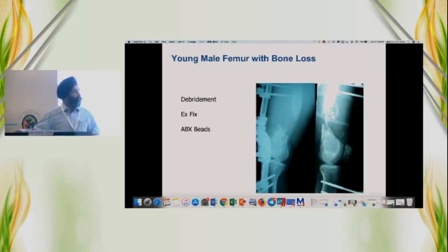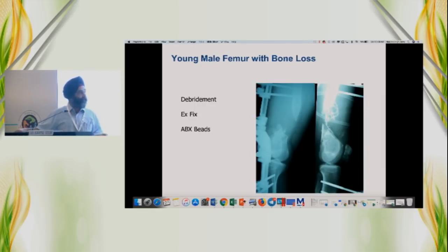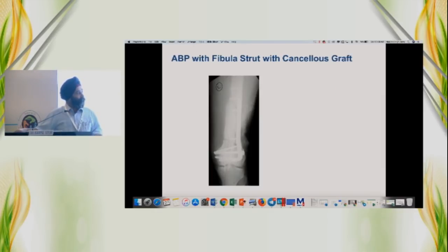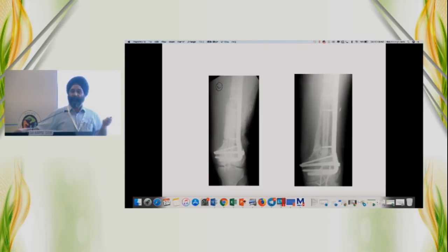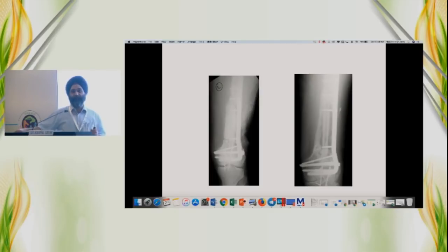Another young male with bone loss — debridement, spanning external fixator, antibiotic beads. Then a fibula was added along with cancellous bone graft. A few months down the line you can see consolidation of the medial cortex; the fibula is still standing proud. These are patients who will need protection for a very long time because fracture of the fibula and fracture of the graft is known. So don't be in a hurry to proceed further.